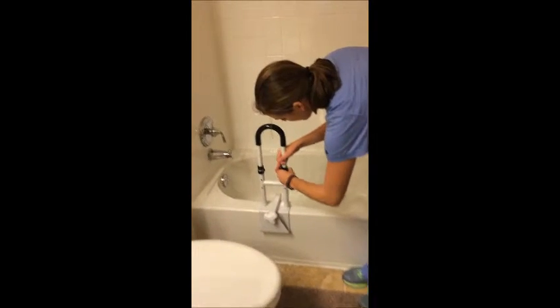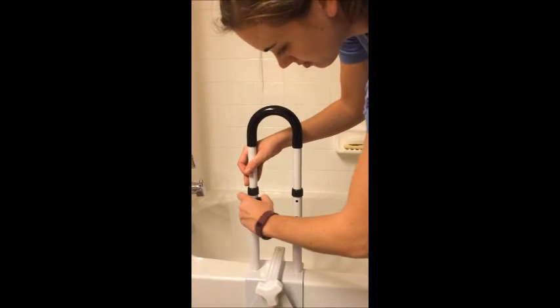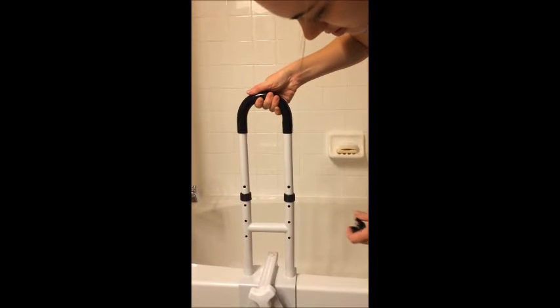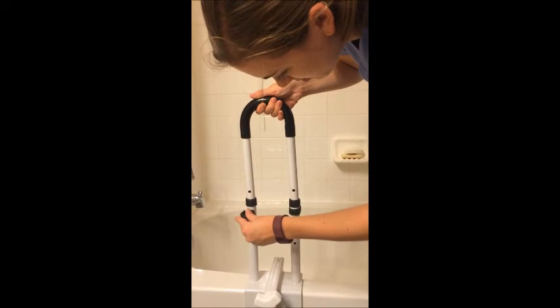The height of the bathtub safety rail can be adjusted by pulling out the pins located near the middle of the rail. Move the rail up or down to increase or decrease the height, then reinsert the pins.